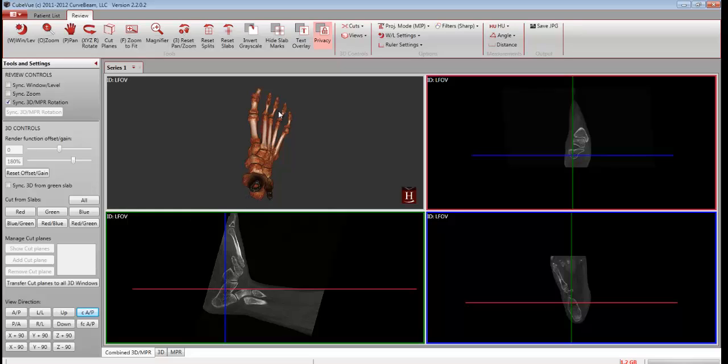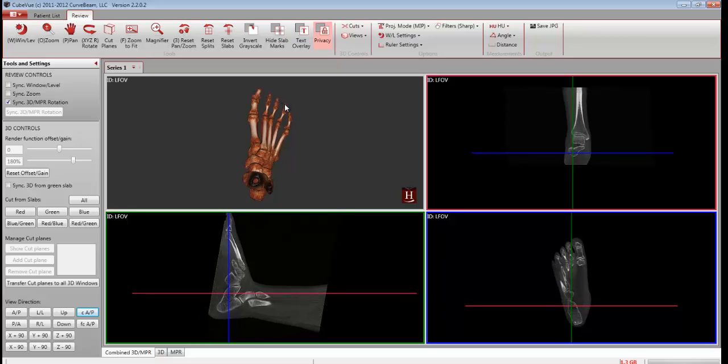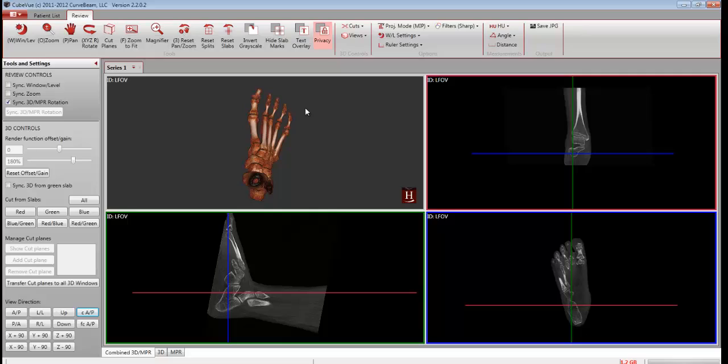This will rotate all images to a conventional standard AP direction. The rotation of the lower left hand corner image needs some adjustment.